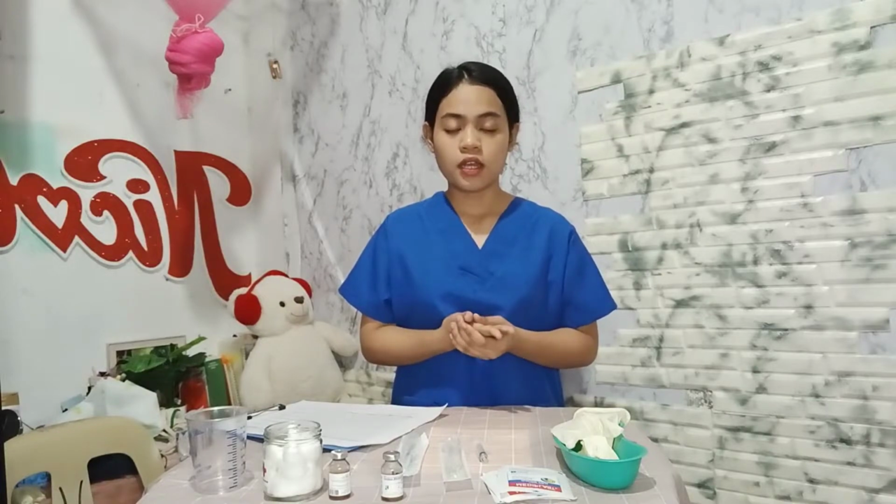Before going to the procedures, we will ensure that we follow the rights of administering medication. These are the right medication, the right dosage, the right route, the right time, and the right patient. Then next, we can go now for the preparation.